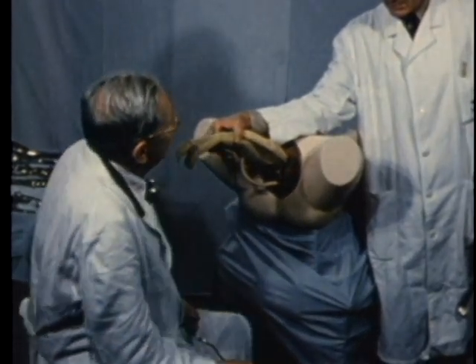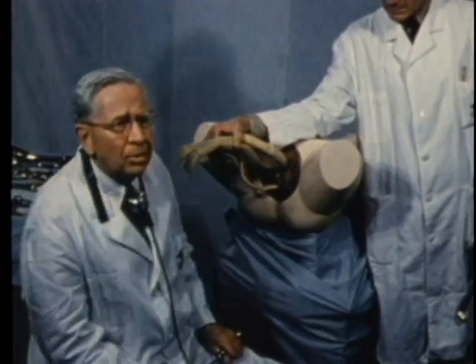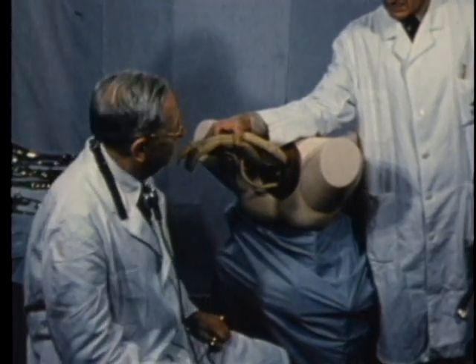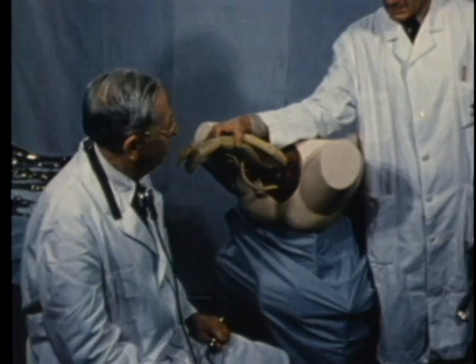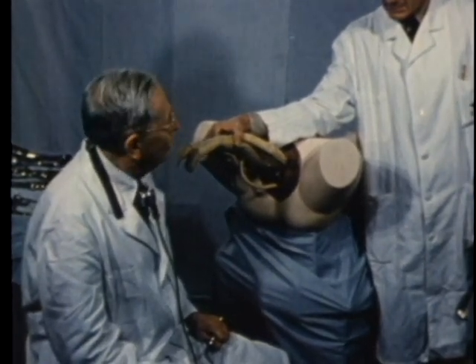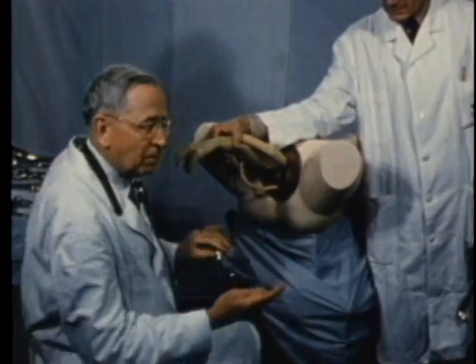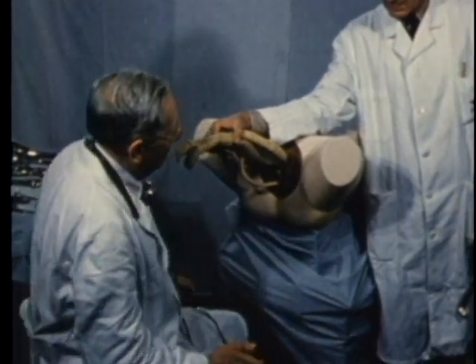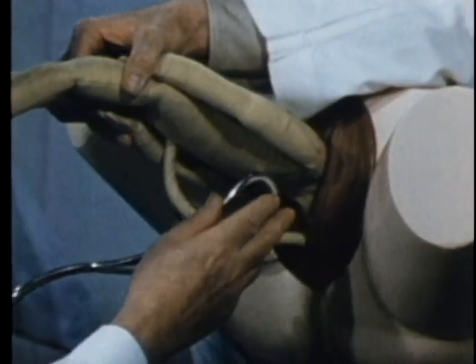But over the years it has been found that it is a little more comfortable to sit down when making the application, and one is not under any great stress as he would be if on his knees and felt that he had to get off the floor without assistance. The first blade to be applied is the left blade, and it is applied from below upward, directly to the sides of the head.